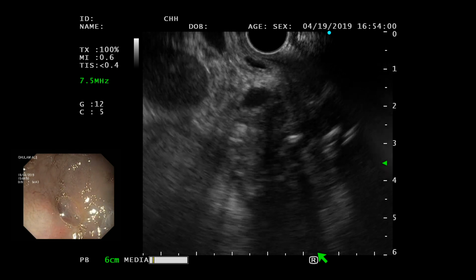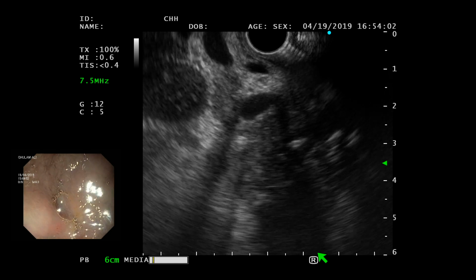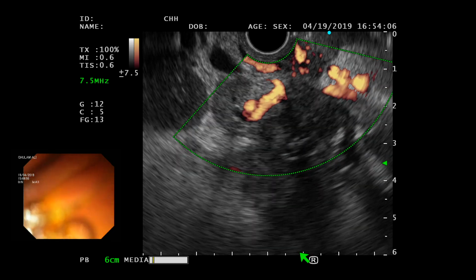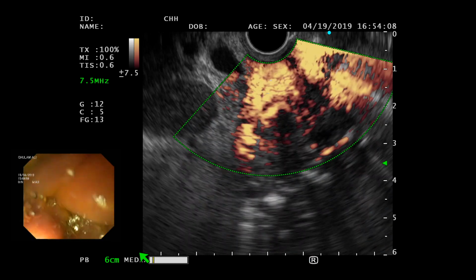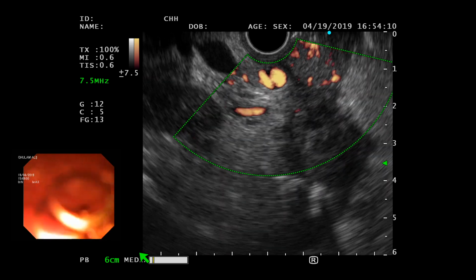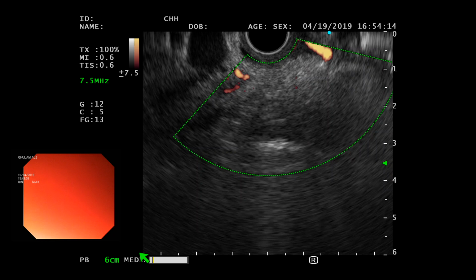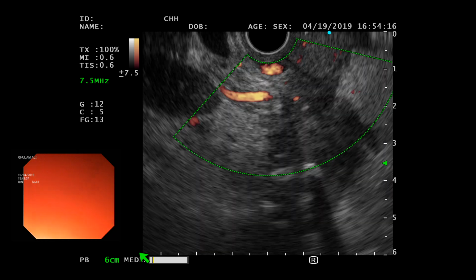So what you do is you look at the duodenal apex, you put your transducer there. देखिए कितने खूबसूरती से वो आ गया, ठीक है ना? ये तो पैंक्रियास ही आ गया नीचे सारा. तो अब अगर पैंक्रियास आपके पास यहाँ पे आ गया है तो आप इसको थोड़ा रोटेट करें इस तरफ. अगर नहीं आता तो जेंटली से पुश करें.